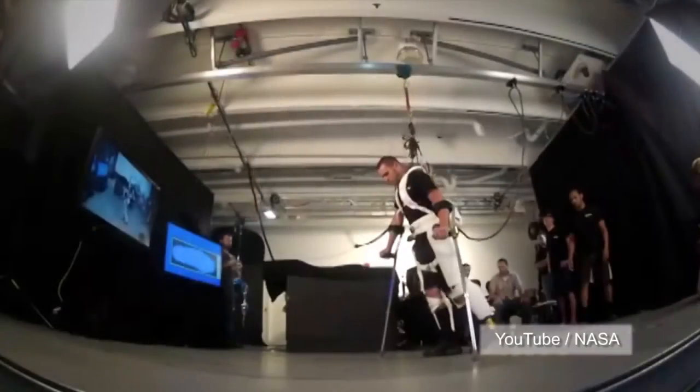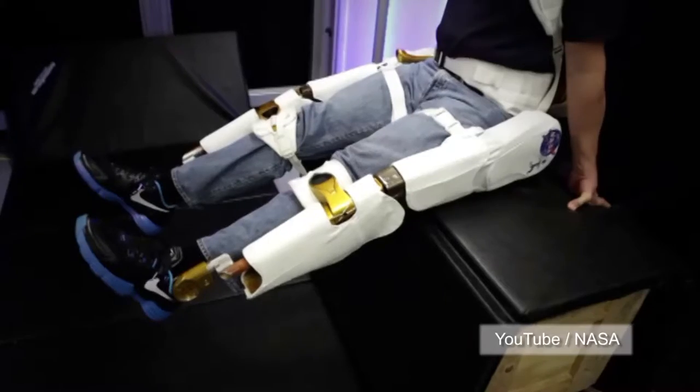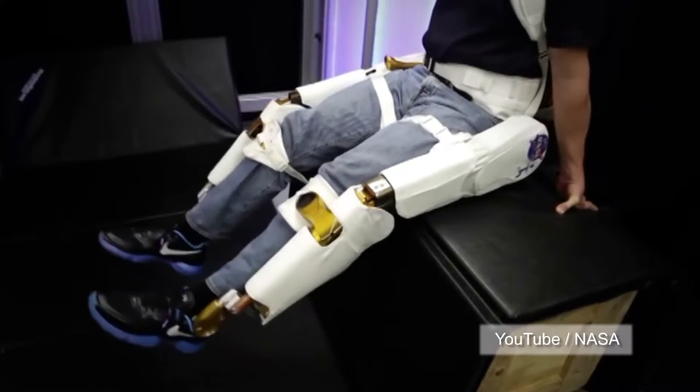X-1 is currently in a research and development phase. NASA says the X-1 is more comfortable, easier to adjust, and easier to put on than previous exoskeleton devices.